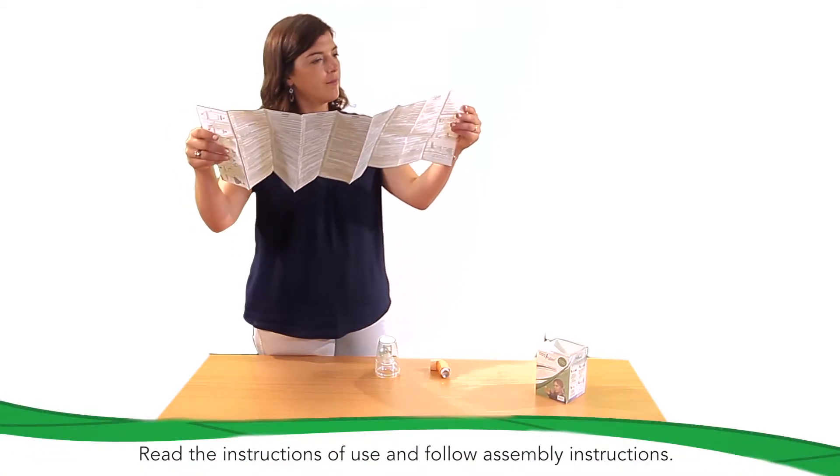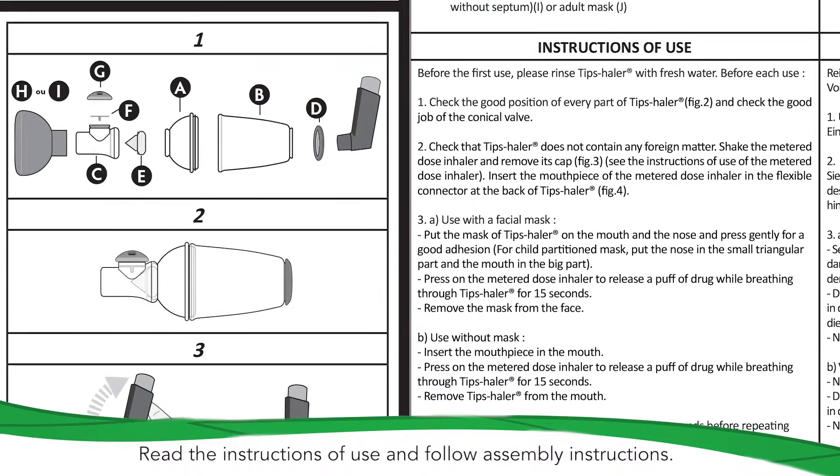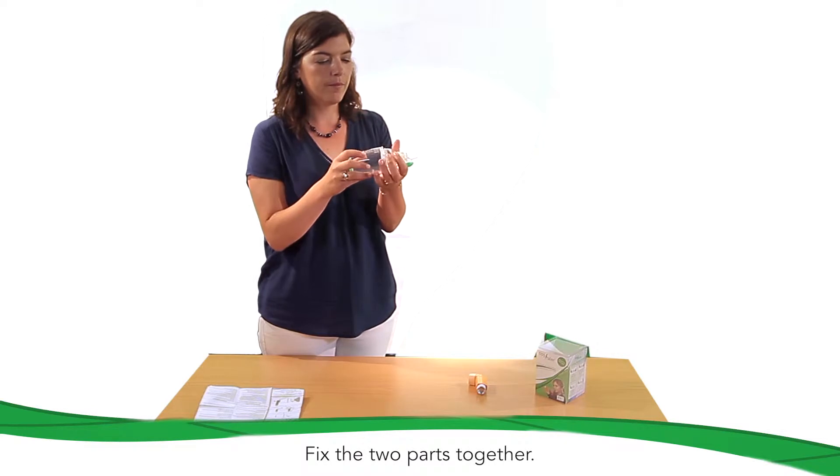Before using it for the first time, please read the instructions of use supplied with the valve holding chamber and follow the assembly instructions. Fix the two parts together and check they are correctly fitted.